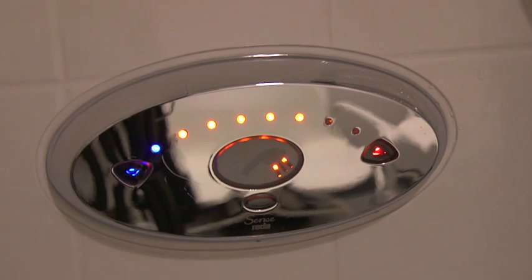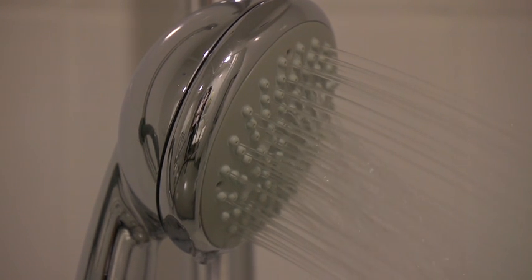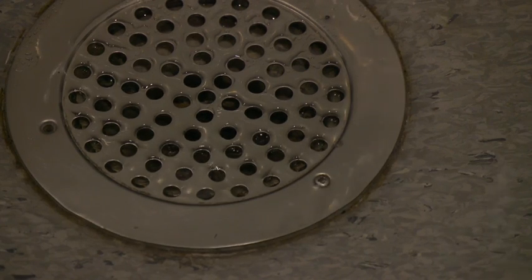Once you have removed the old dressings, you can use your own usual shampoo or shower gel and give the limb and frame a good clean. Rinse it well to make sure no soap remains and dry it gently with a towel.